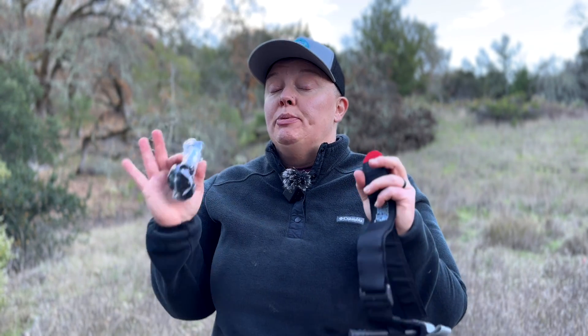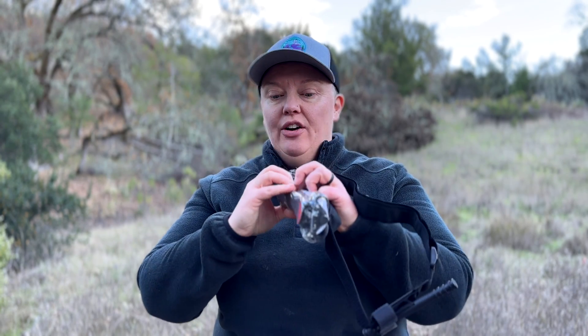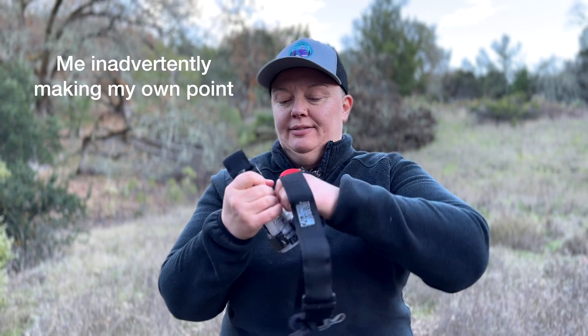A tourniquet should be a part of everyone's first aid kit — ideally two of them, and I will explain why in a little bit. Never put one in there still wrapped up in the plastic, because if you're genuinely in a situation where you need it, trying to open this — especially if your hands are bloody and wet and you're freaking out — is not easy. It's hard enough to do this with your hands dry and not under duress. So open that up, dispose of your waste properly, and carry two.